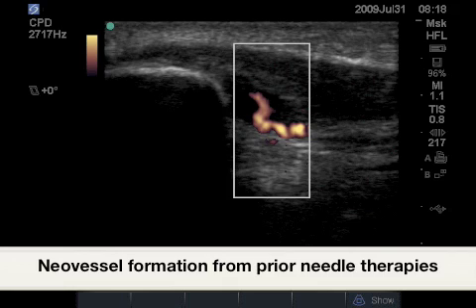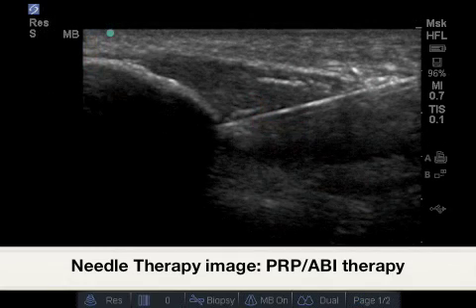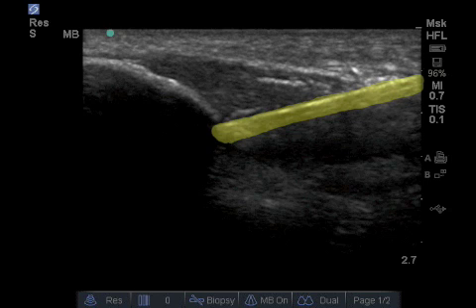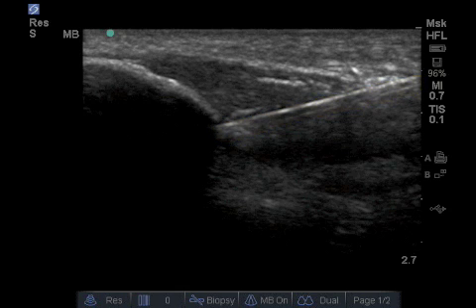Using power Doppler at this site also shows a large vascular presence not normally seen in the normal infrapatellar tendon. Here is an example of a needle coursing through this tendon, creating new paths for vascular formations, as seen with ABI therapies and PRP therapies.